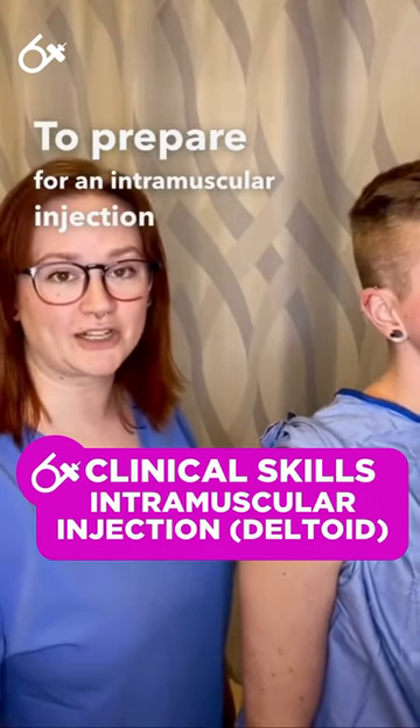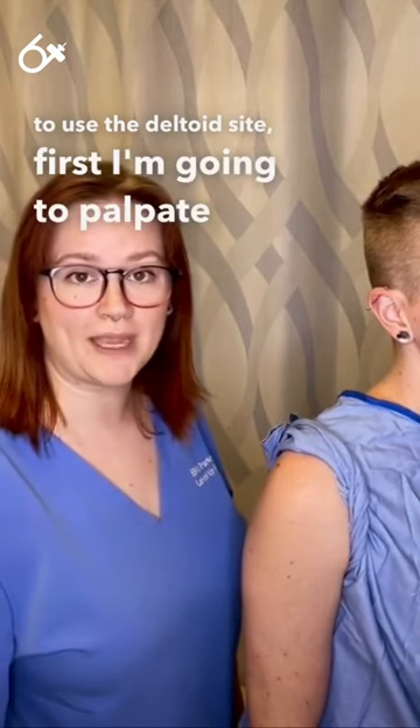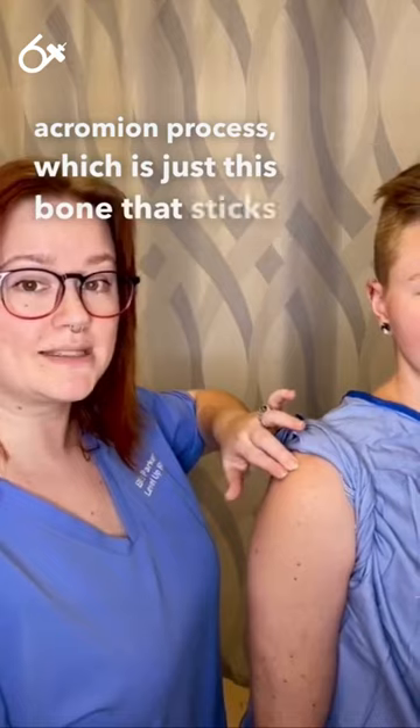To prepare for an intramuscular injection using the deltoid site, first I'm going to palpate the acromion process, which is the bone that sticks out right here.